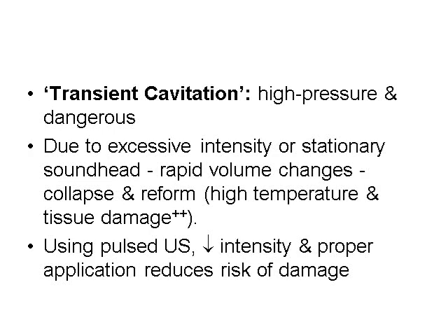The risk of transient cavitation is reduced by a number of measures, including using pulse ultrasound, reducing the intensity, and applying the ultrasound correctly using a moving treatment head at right angles to the tissues with an appropriate conducting gel.